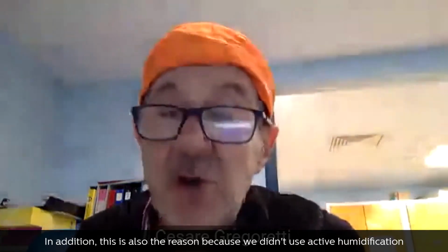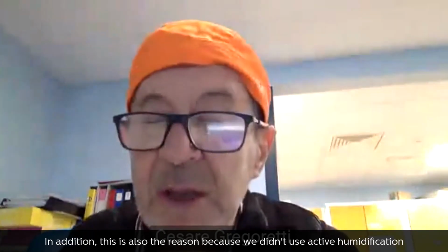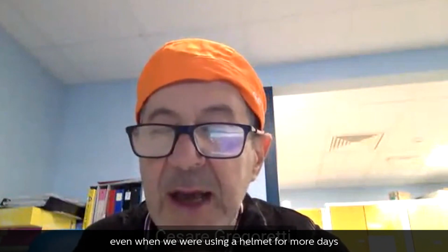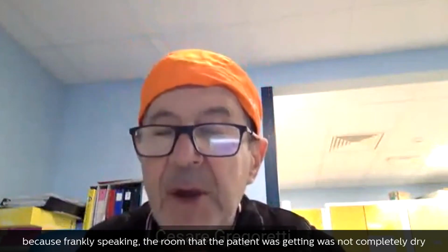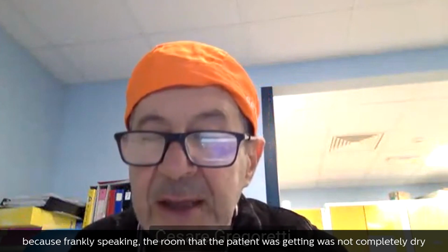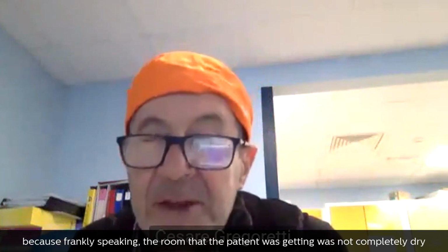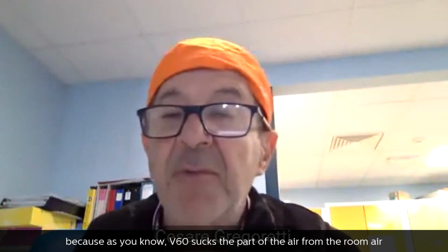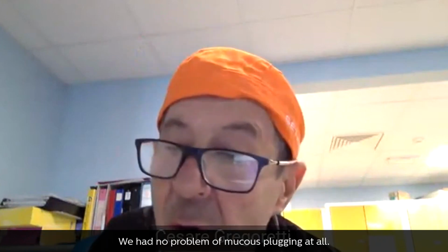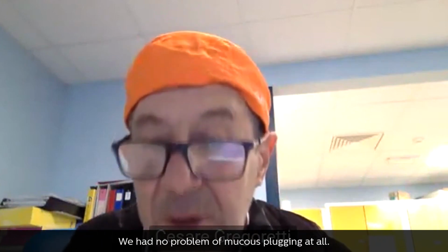In addition, this is also the reason why we didn't use active humidification, even when we were using a helmet for more days. Frankly speaking, the room air the patient was getting was not completely dry, because as you know, the V60 sucks part of the air from the room air. So the room air is not completely dry. We had no problem of mucus plugging at all.